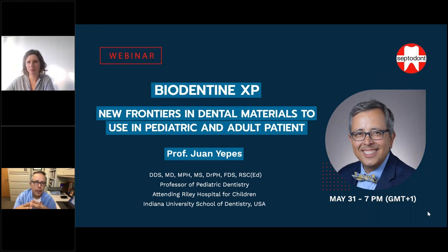And we don't have a microscope in our eyes. I know some of you may work with microscopes, but I will remove a couple of millimeters, and I will very carefully avoid, as much as I can, continuing to remove the dentin, because if I do that, then I will expose the pulp. And if I expose the pulp, it's a completely different game, because we don't do direct pulp caps in caries exposures. We don't do that. So then you will need to move into the pulpotomy.